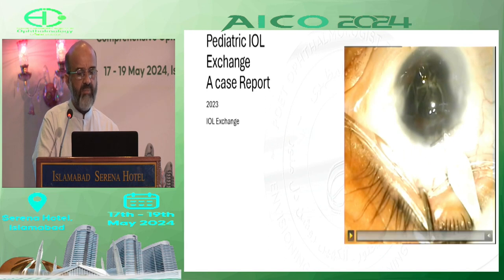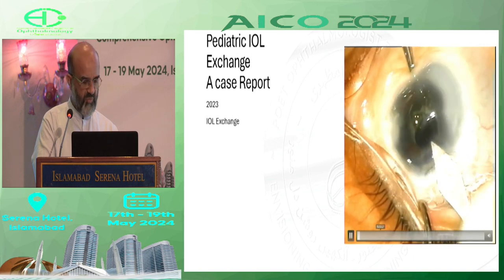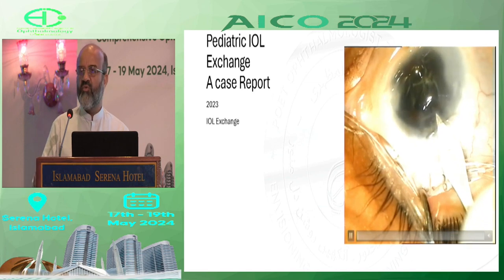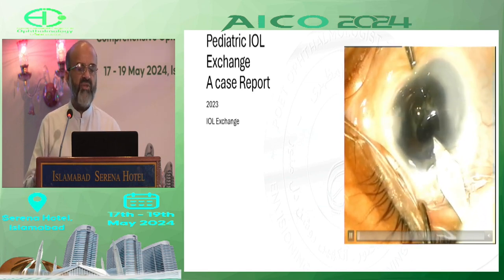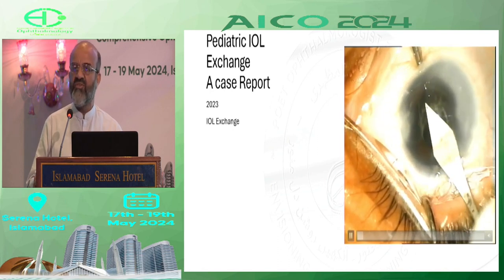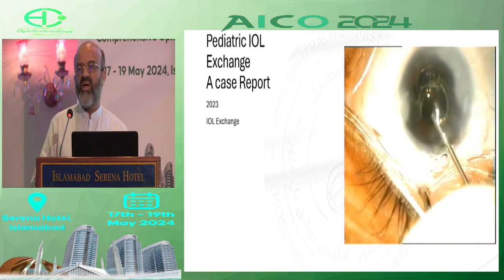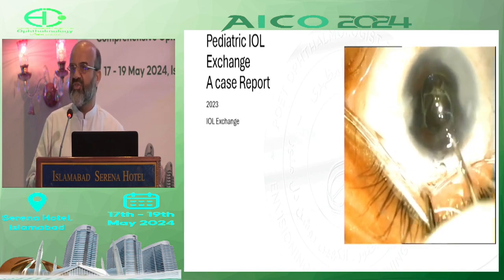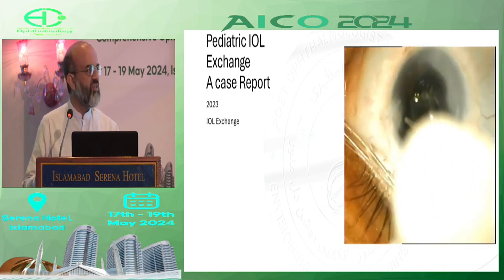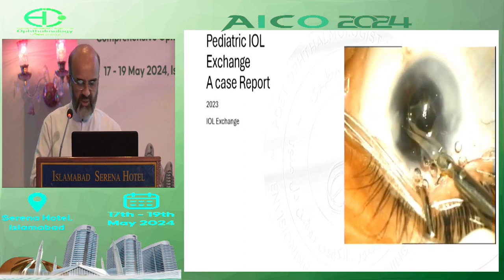This is the other eye. The same procedure. The incision is being performed, and the wound will be a little enlarged. The situation is a little different. There is more fibrosis and synechia, but the visual axis is still clear. And we were able to successfully explant the IOL with wound-assisted folding and explantation, followed by Acrysof multi-piece injection and placement in the sulcus.